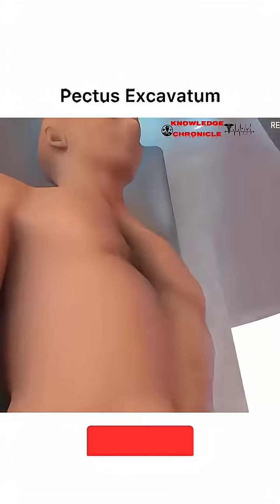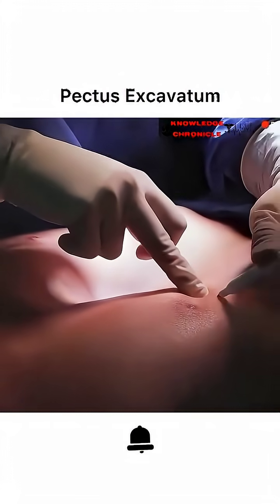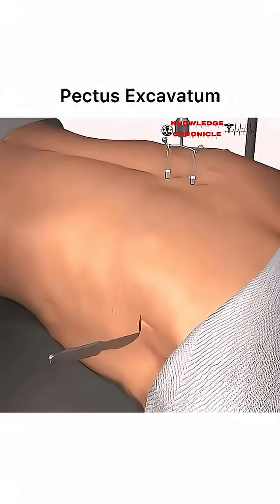The procedure starts with general anesthesia for comfort. The surgeon makes small incisions on either side of the chest, typically just below the armpits.